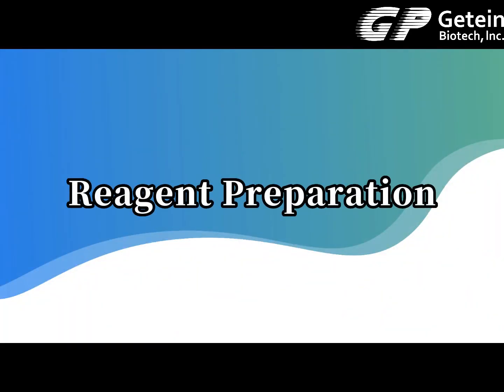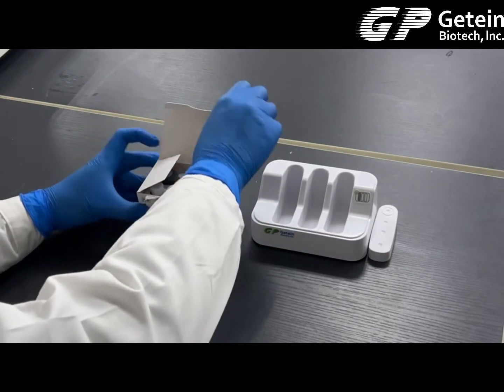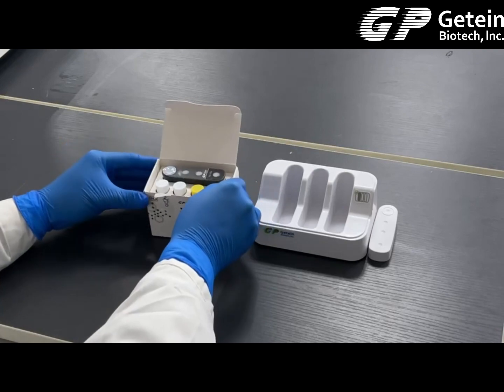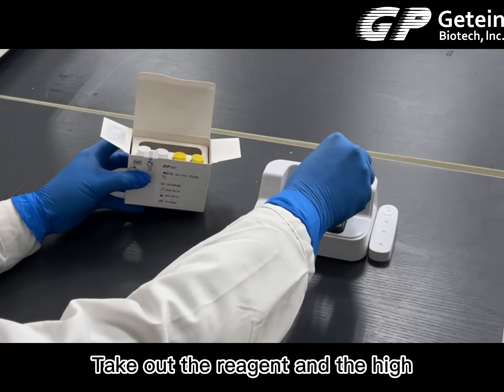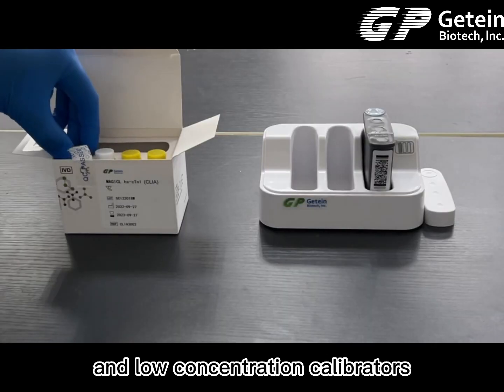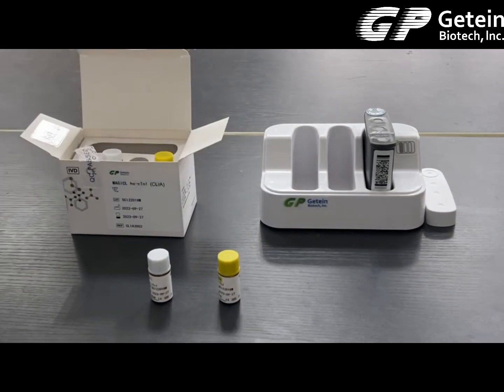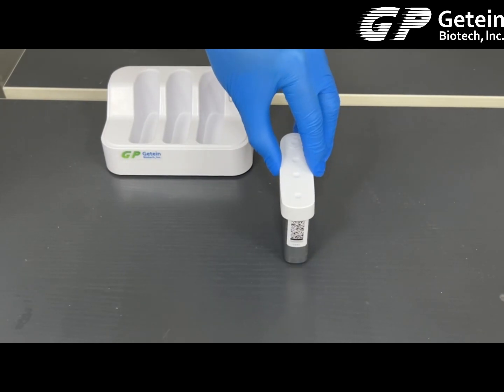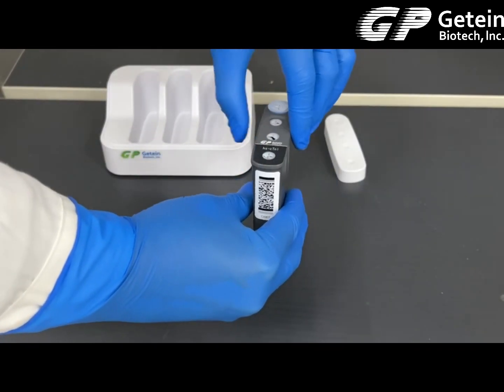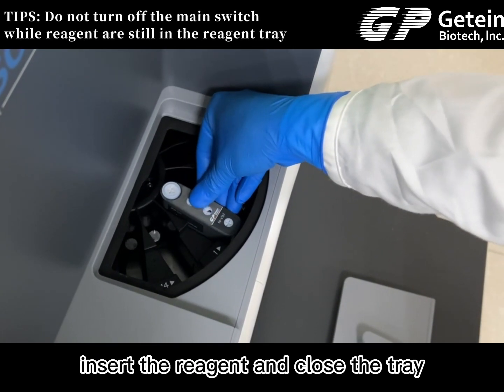Reagent preparation: open the kit and take out the reagent and the high and low concentration calibrators. Leave the reagent on the magnetics pre-mixing tool for a few minutes. Use the piercing tool to open the reagents. Then uncover the reagent tray on the right side of the machine, insert the reagents, and close the tray.